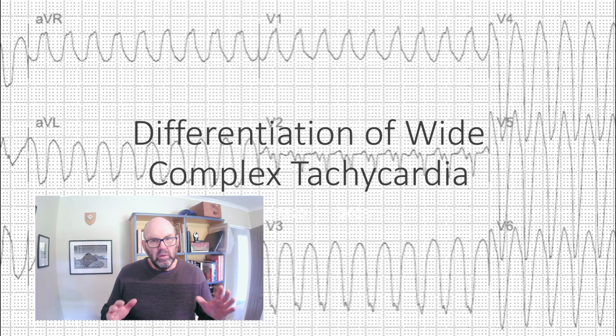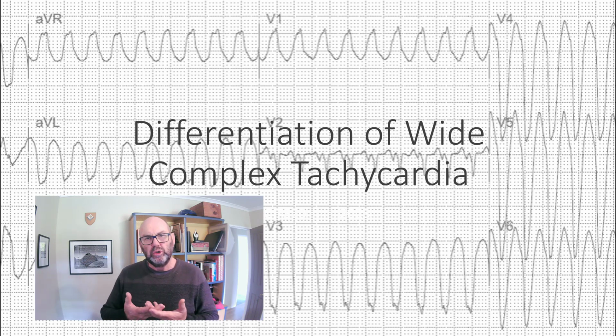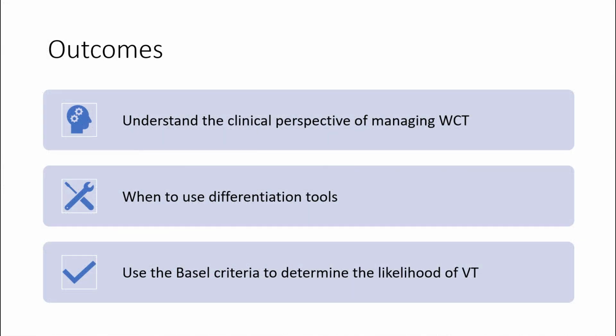Kia ora. Welcome to this session, and we're going to discuss when and how to go about differentiation of a wide complex tachycardia. Wide complex tachycardia can be associated with some worrying pathology and is a likely cause for low perfusion status. Now, if this is the case, rate control or cardioversion is going to be required.